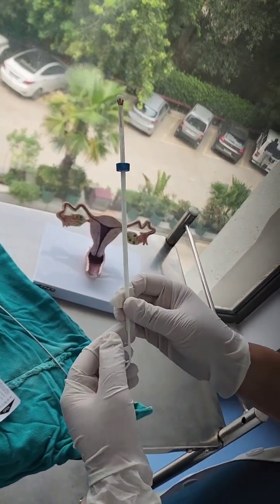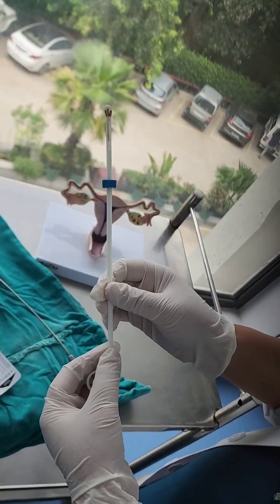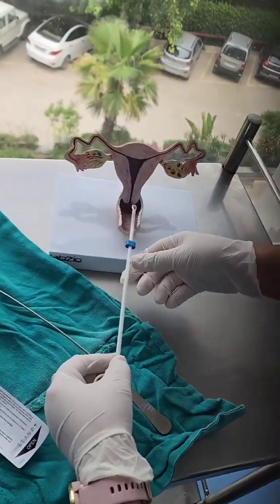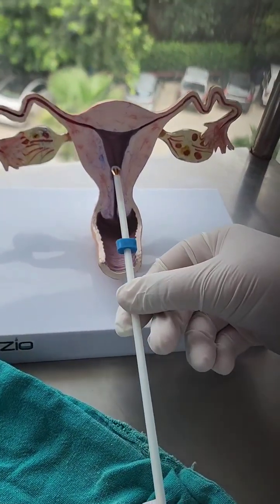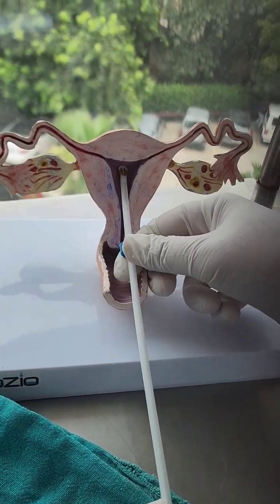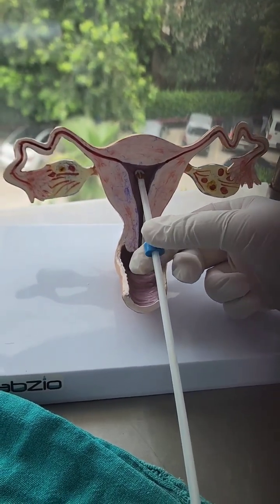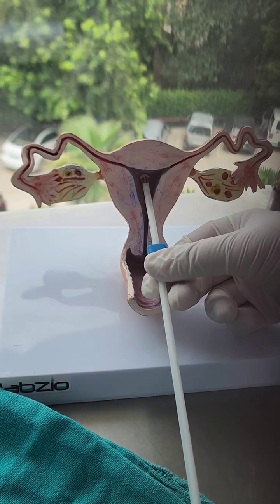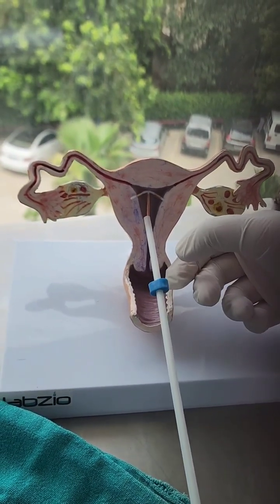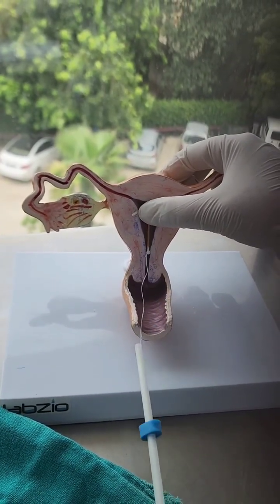The technique of insertion is called the withdrawal technique, and this is important to prevent perforation of the uterus. We introduce the copper T inside the uterine cavity, and because the length has been adjusted prior, we simply withdraw the inserter over the plunger so that the arms get released within the uterine cavity. We then simply take out both the plunger and inserter together.